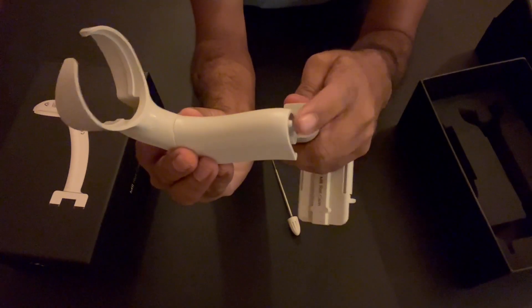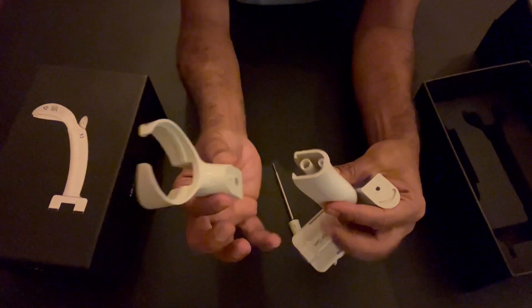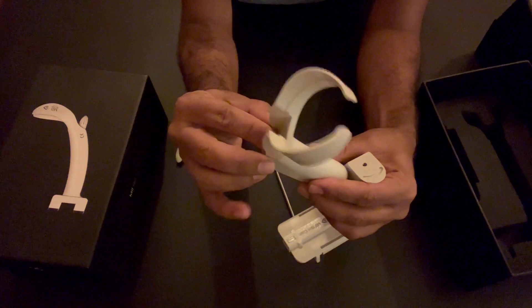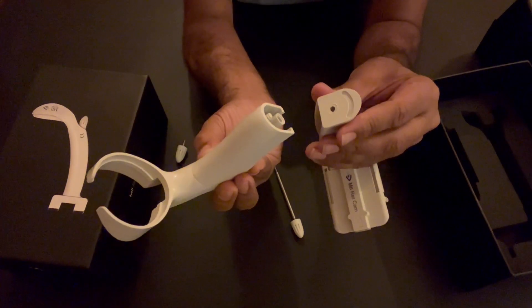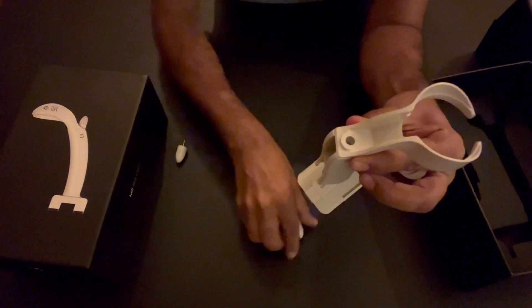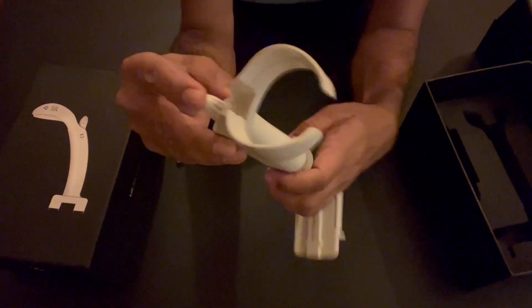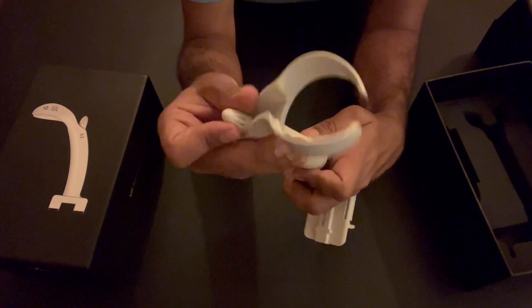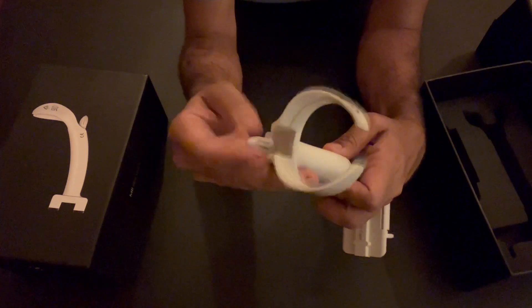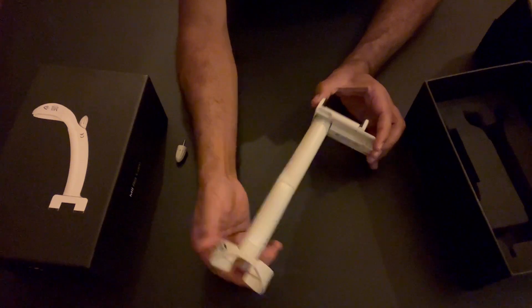The elevation on one part goes inside the hole on the other. On one side there is an elevation and on the other there is a groove — these fit together. Hold the two parts together, then put the screw through the hole and screw it in. Now you can see this longer version of the device is fully assembled and ready.